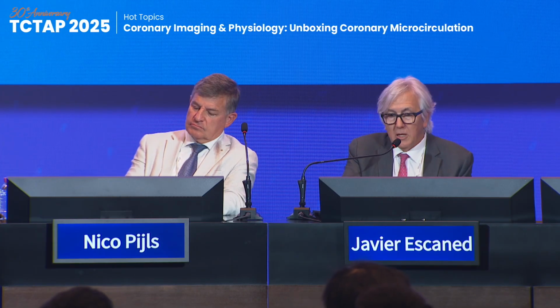Javier, I don't know, what do you do in Madrid? Do you do ad hoc acetylcholine, or do you plan that? We make the mixture, we make the solution in the cath lab, yes.